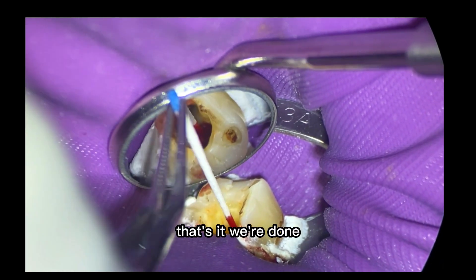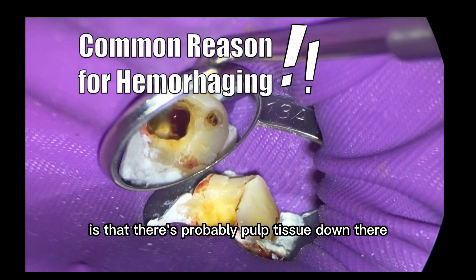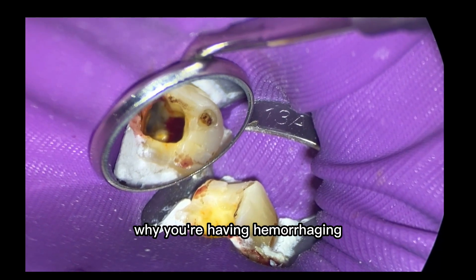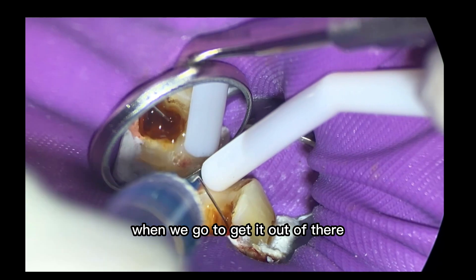The problem was that he was still feeling something when I was going down there. So with the cones and whatnot I was like, okay, we're done. But what that tells me is that there's probably pulp tissue down there — that's one of the most common reasons why you're having hemorrhaging. Stick around later in the video because you'll see what that pulp tissue looks like when we go to get it out of there.